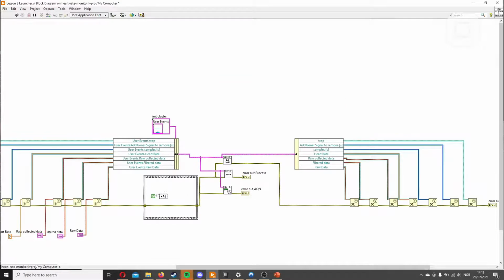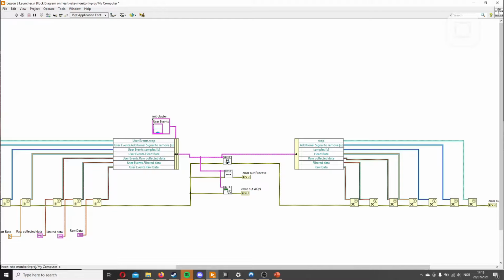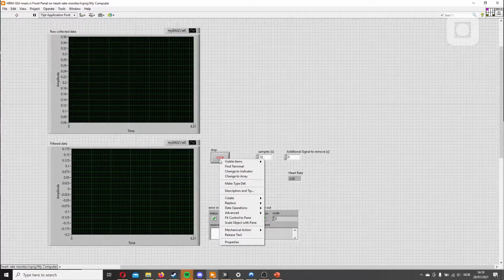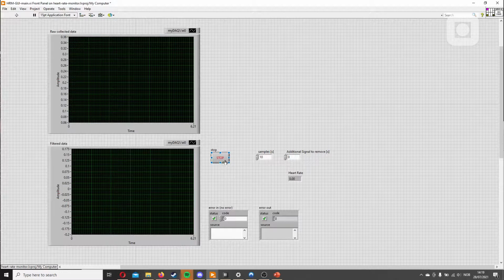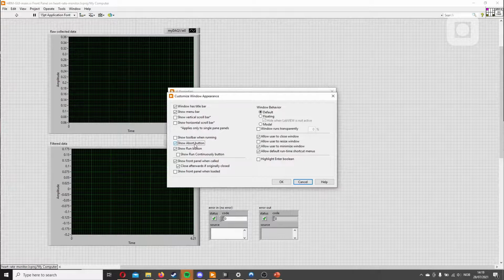And we see the remnants of this variable here, and we can delete it, remove and rewire. And we have to fix this here too. Since we're not using this as a local variable anymore, we can just put it back into latch when released, which means when we press it and it's red, it pops out again. Another thing that happened when we edited it is that the stop button here got removed. Since we're still debugging, I would want it back. Oh, we press show abort button, and yeah, that's it.